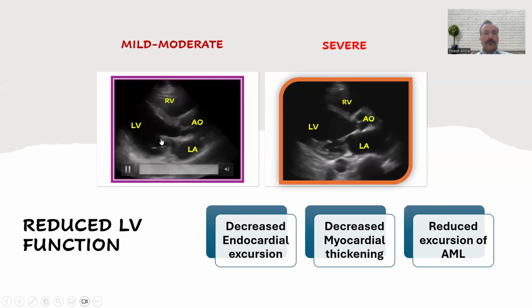can see for yourself that the squeeze is not that good. Endocardium is not well moving towards the center of the cavity. The myocardial thickening has decreased. The anterior mitral leaflet is not touching the interventricular septum.